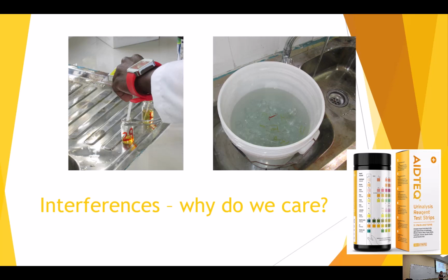So in other countries, the strips actually do have an ascorbic acid spot, Europe in particular. When I was in Tanzania, all of our supplies came from Europe, so all the strips had that ascorbic acid pad on it.